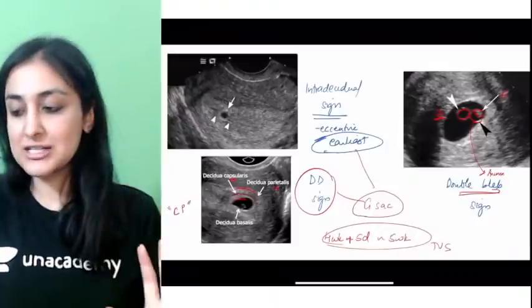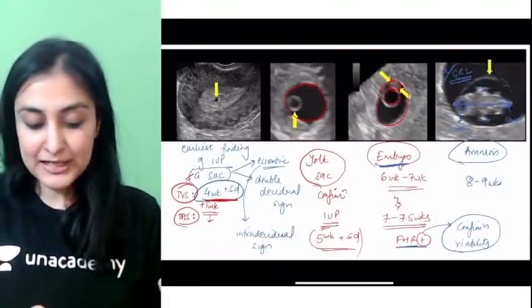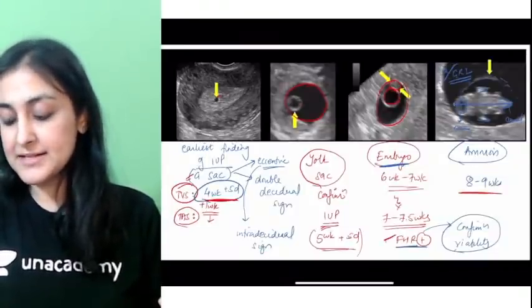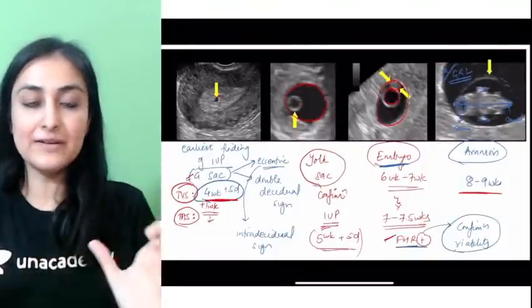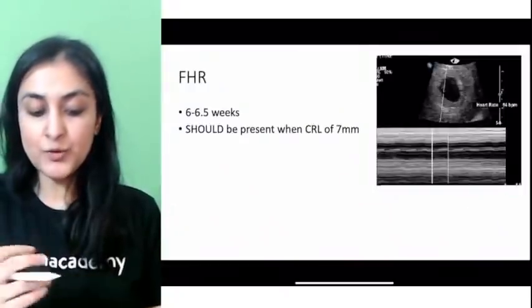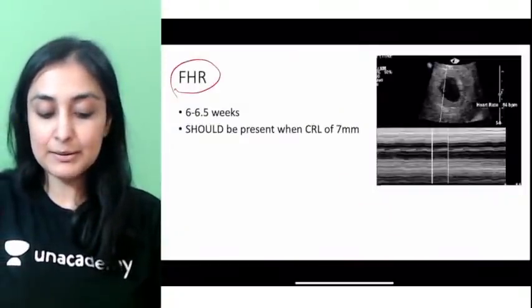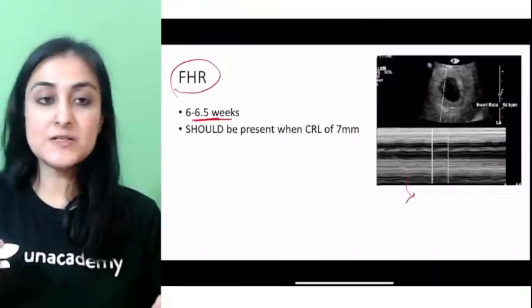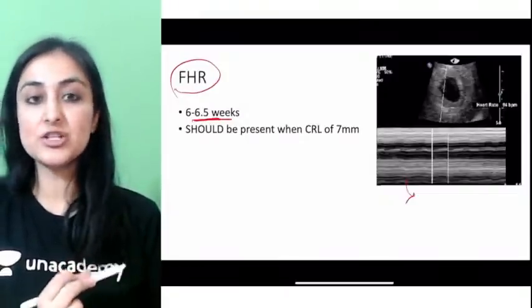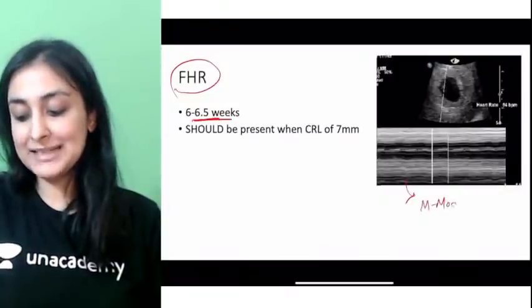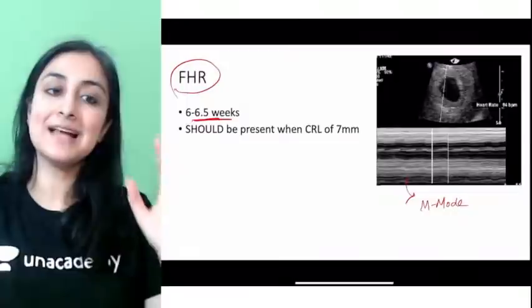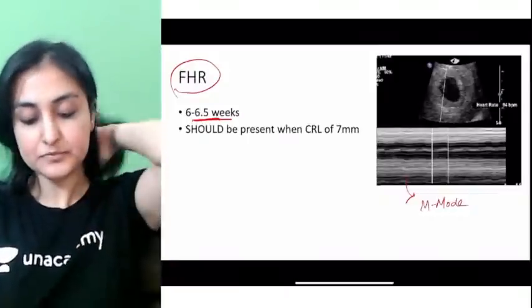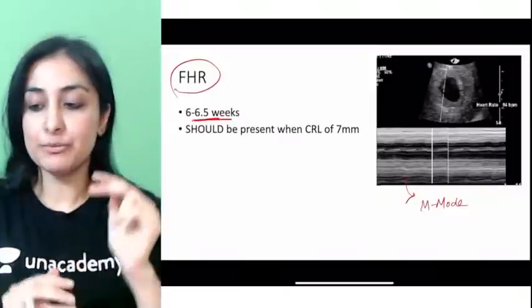So the sequence from 4 to 9 weeks: G-sac, yolk sac, embryo, fetal heart rate, and amnion. For fetal heart rate measurement, we use M-mode ultrasound — the same mode used for pneumothorax assessment. The fetal heart rate is seen at approximately 6 to 6.5 weeks on TVS.